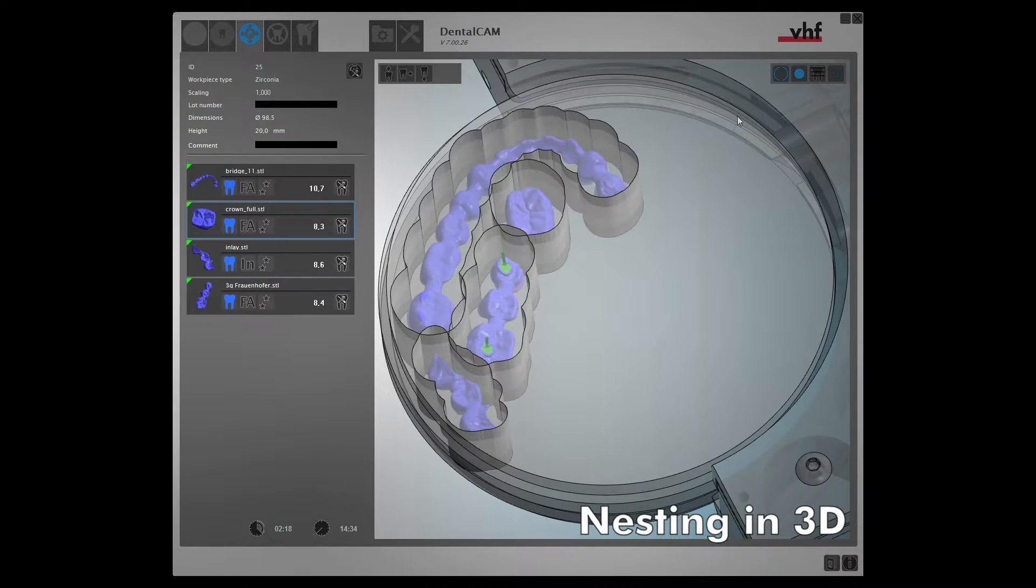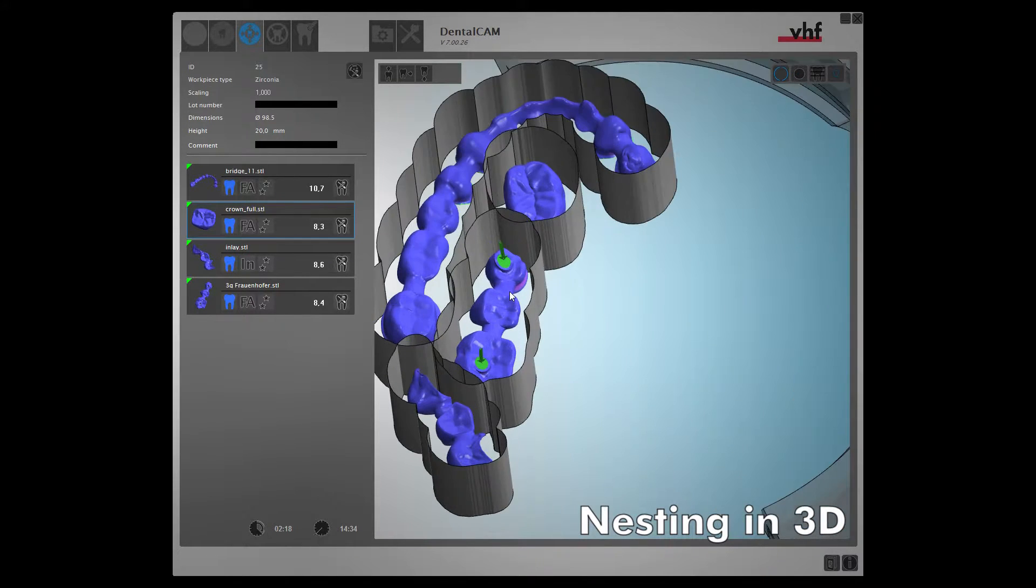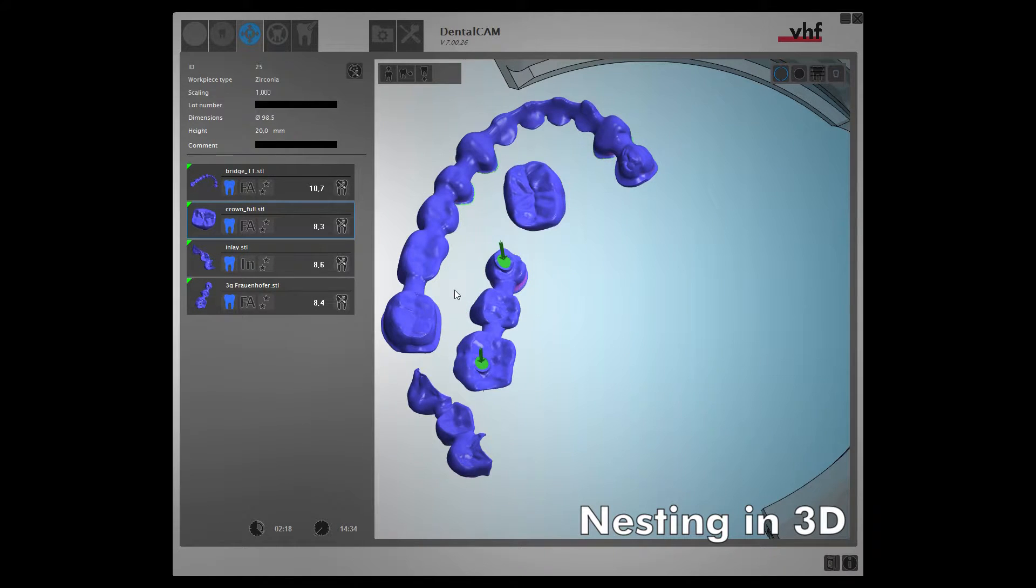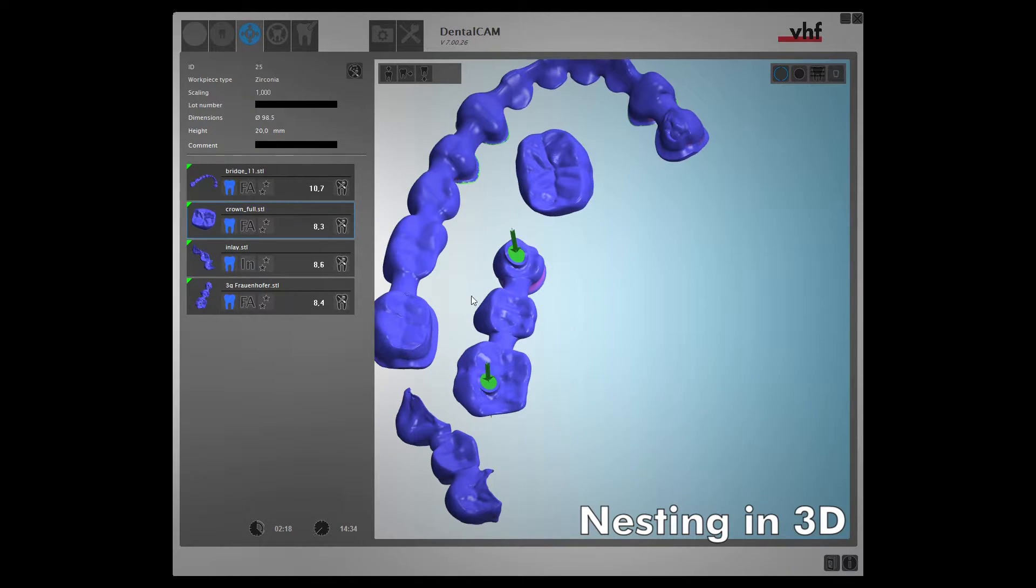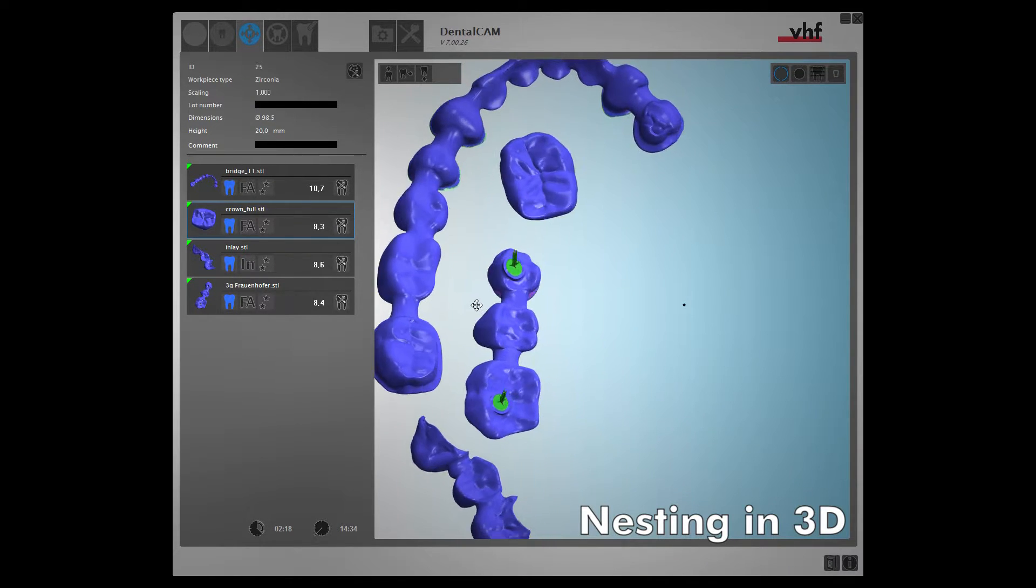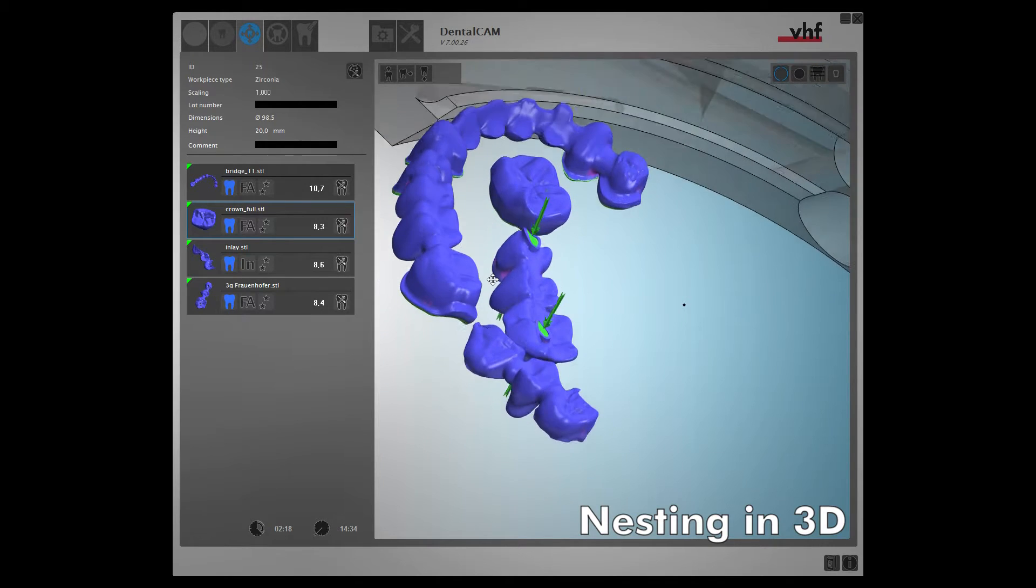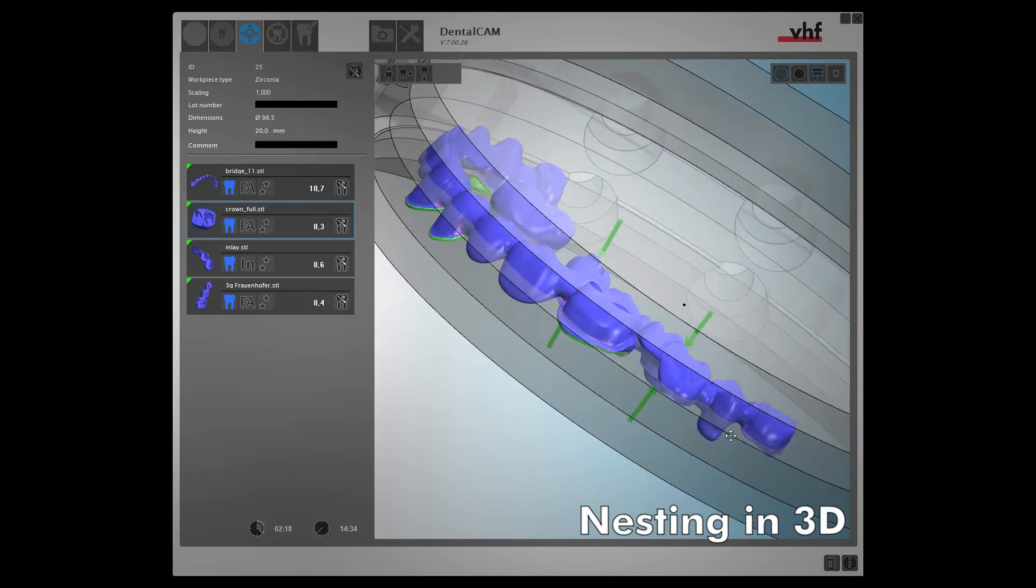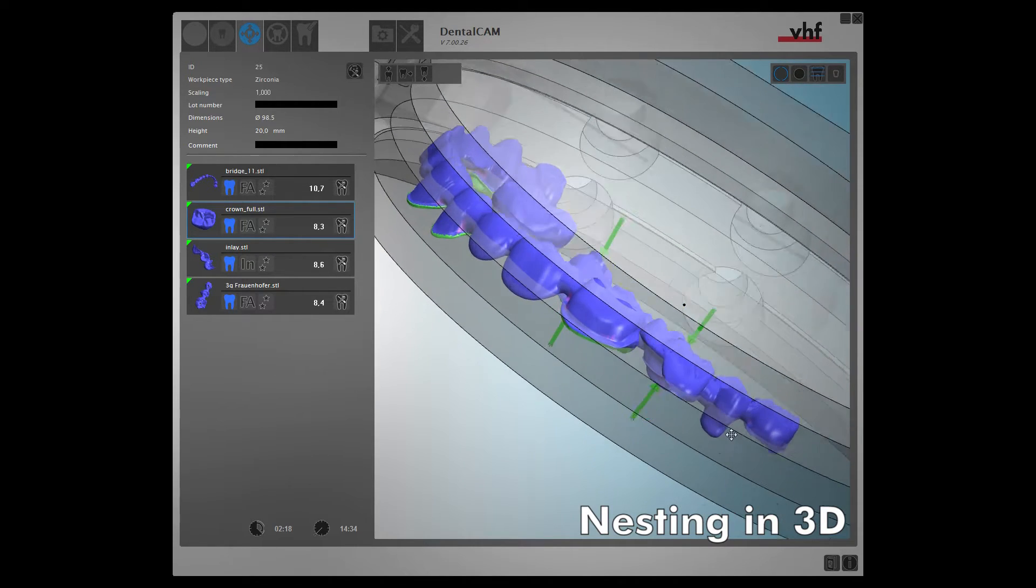This 3D view is also customizable. You can hide elements that you don't need, allowing you to concentrate fully on the object itself. Or, you can show important elements, for example, to easily work with multi-layer materials.